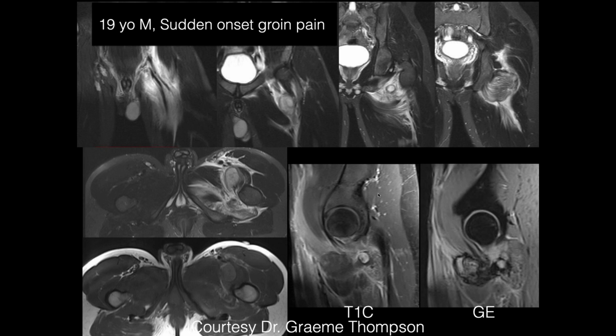So a 19-year-old male, sudden onset groin pain, looking along the left hip near the iliopsoas insertion. You see a lot of heterogeneous signal. It could be a hematoma within the bursa as well. A lot of muscular edema also.